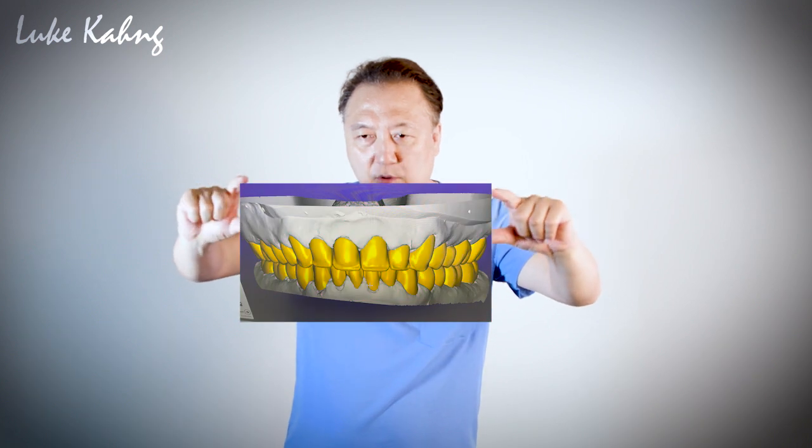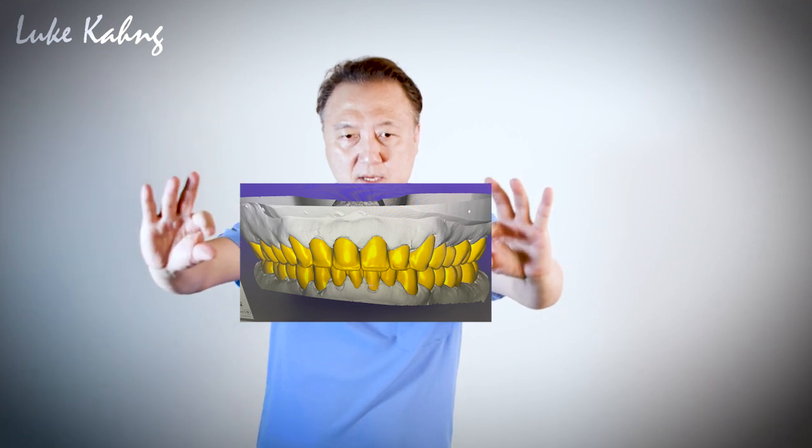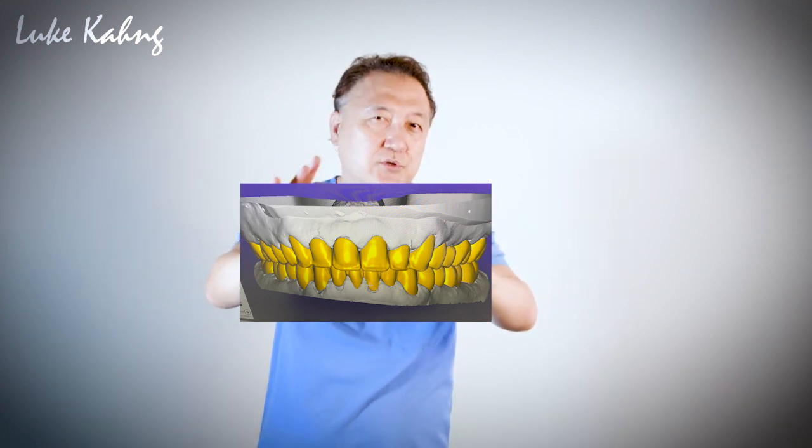That's great. And we design, we sit down, and then we spray, and then we design individual. It's a little bit more complicated than we think, because of the occlusion. It's hard to match because it means full contour from the top and bottom teeth. Sometimes high, sometimes low. It's kind of a little tricky, but that kind of video I can make another version. It's so complicated. Meaning after we design it, after we sinter, it looks like some is high, some is low, which I don't like.